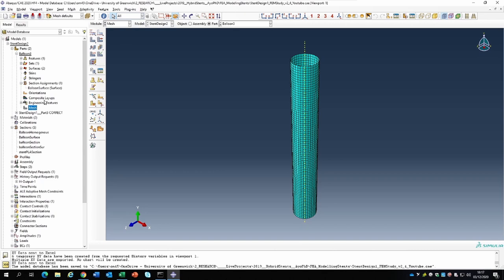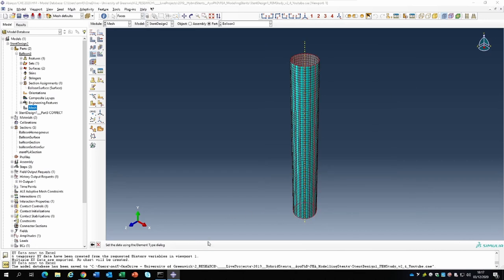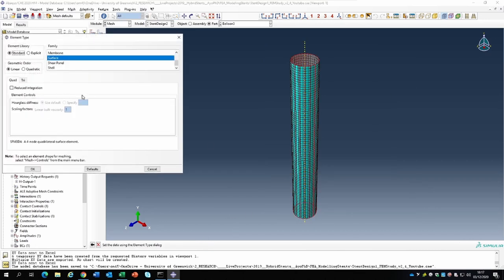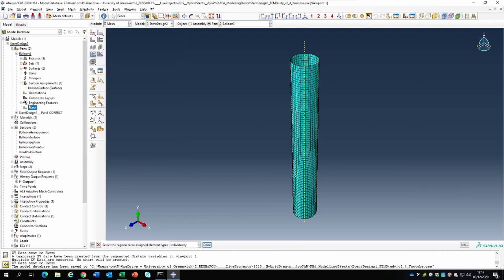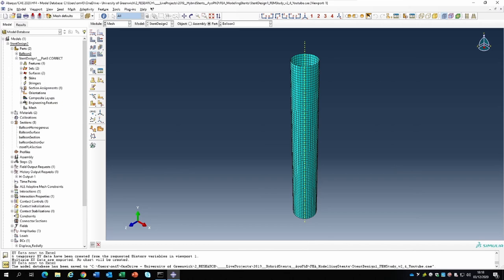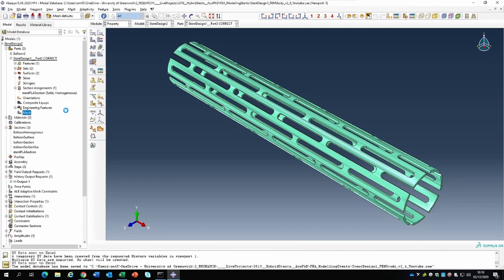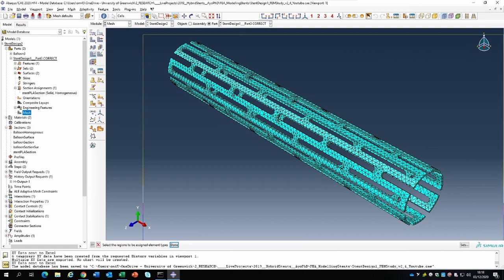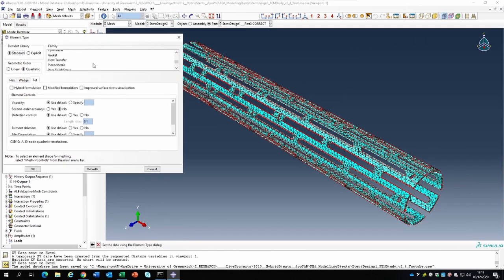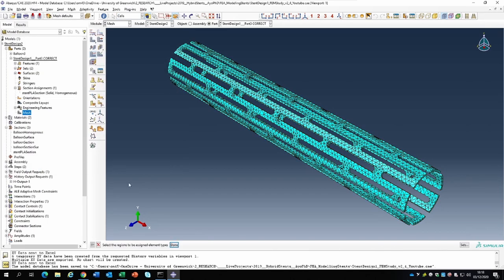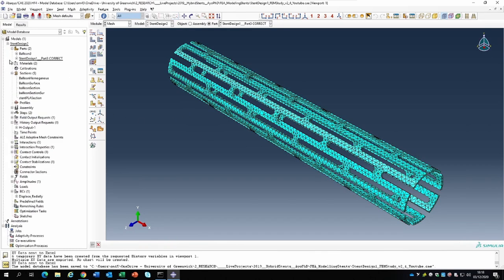In meshing the balloon we specified the element type as a surface element, not surprising for the balloon. For the stent, the element type specified was a 3D stress continuum element. We meshed the stent using tetrahedral elements. Please watch that previous video for more details on these settings.